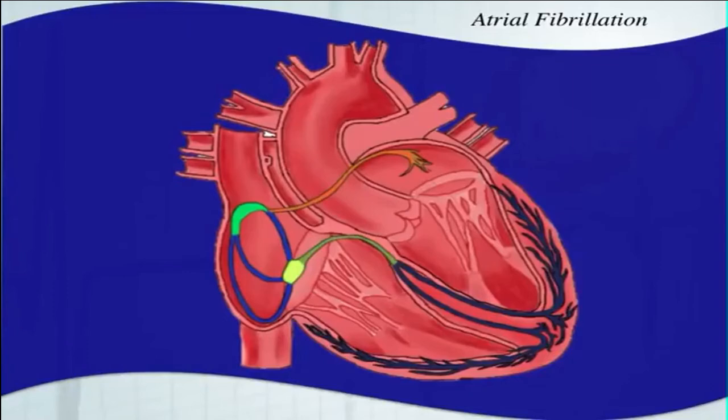All right, atrial fibrillation is caused by a fibrillating atria. Basically, they're quivering. The atria are quivering. They're not really depolarizing fully the way they should. They're depolarizing close to 800 times per minute, which is not sustainable with life if you depolarize the ventricles that often. In fact, we call that ventricular fibrillation, which we're going to learn about later. So the atria are quivering.